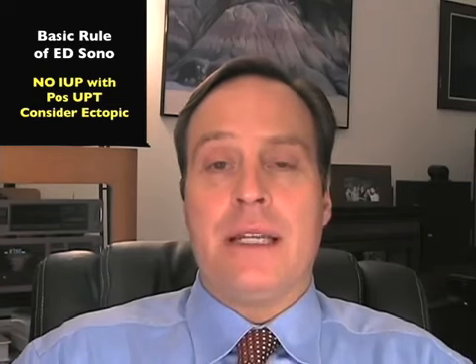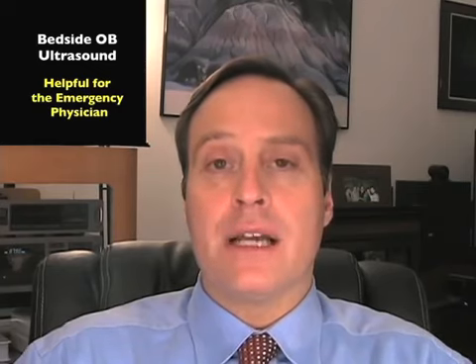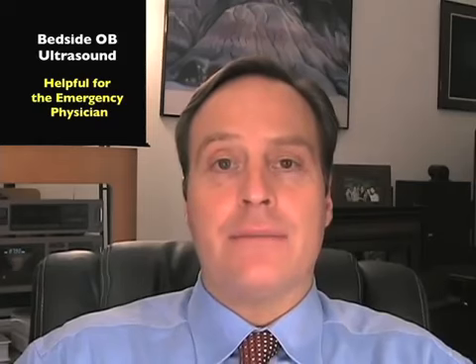So I hope this case has been helpful for you, and I think it really again shows the benefit of employing emergency bedside ultrasound, especially in the pregnant patient.